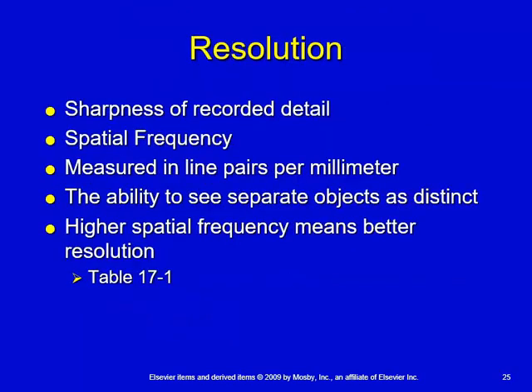When we're talking about resolution, we've got contrast resolution, we've got spatial resolution. And if the only thing that we refer to is resolution, then that's going to be your spatial resolution. Contrast resolution is always going to have that quantifier contrast in front of it. So resolution, spatial resolution, those are your geometric factors. We're talking about sharpness or recorded detail. Spatial frequency.